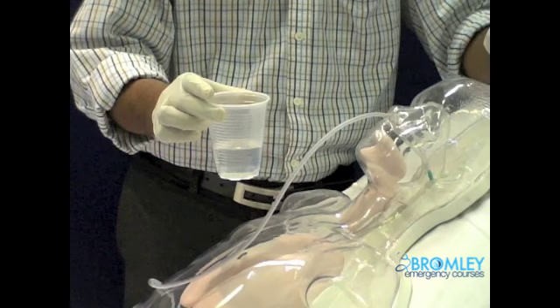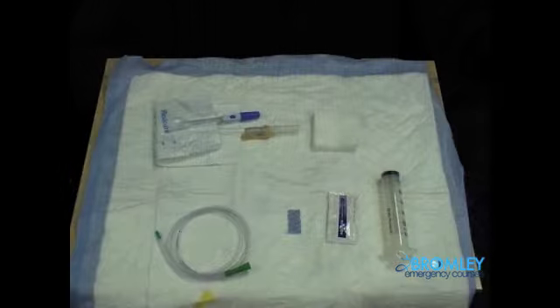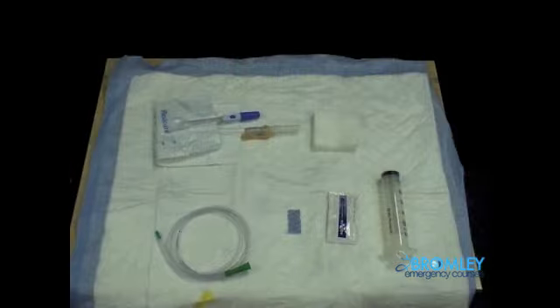As in all procedures, universal precautions are essential. This would include hand washing and donning of gowns, gloves and goggles. Take a moment now to familiarise yourself with the equipment seen above and to think about the indications for placing a nasogastric tube.